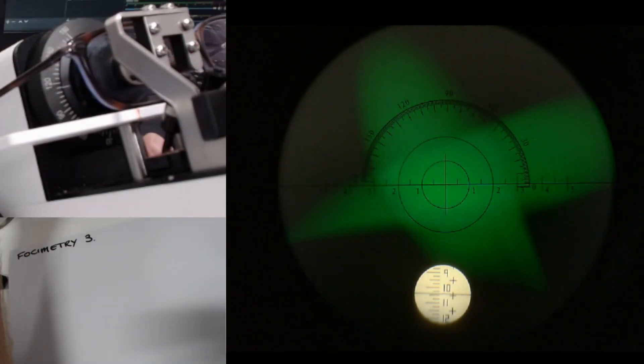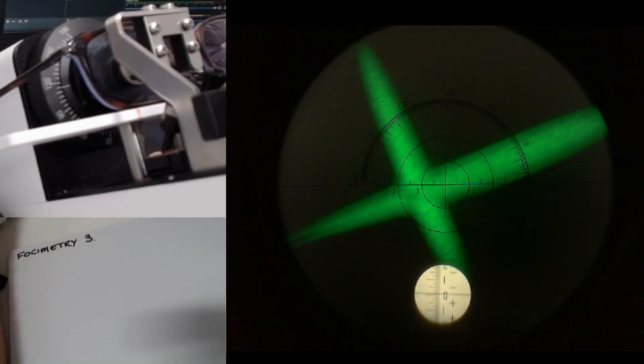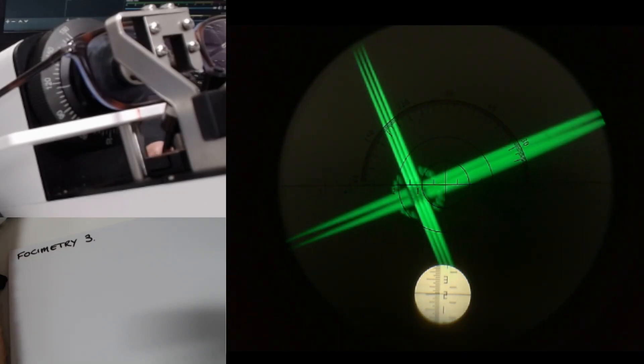We put the glasses on. We're starting way up in the plus because we're working in minus cylinder. I'm going to wind the scale down towards the minus, and that's going to come into focus round about there.